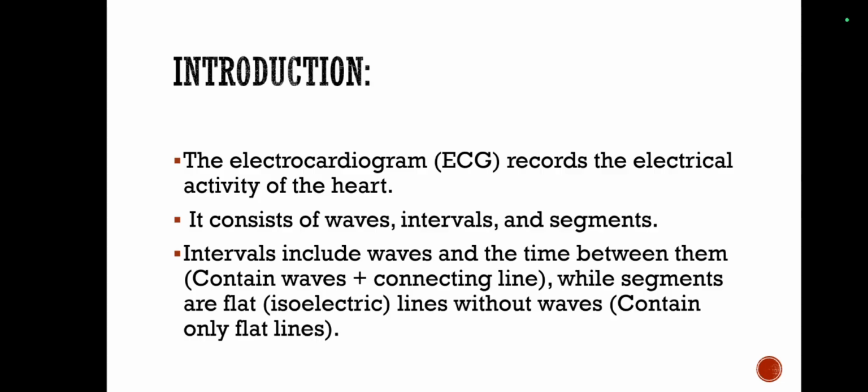First of all, ECG is the electrical activity of the heart. It consists of waves, intervals, and segments. In this presentation, we are going to see about the intervals and segments in the ECG.